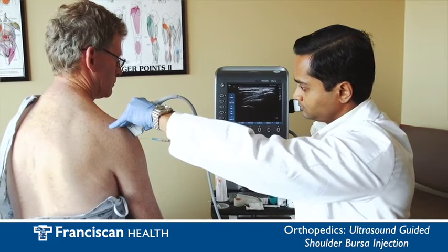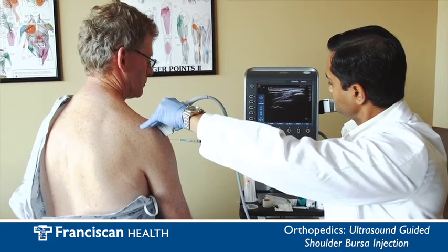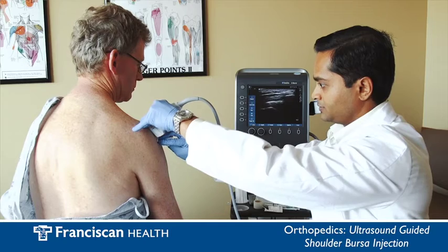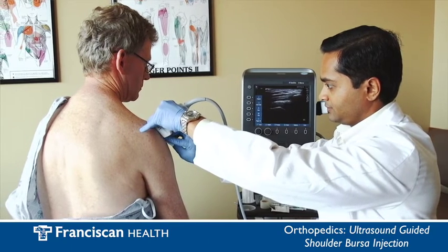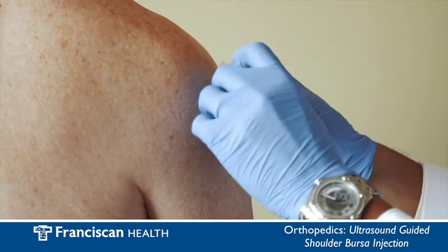Now that the exact injection site has been located and you are comfortable and informed I will finish the bursa injection. After the injection I will use gauze to clean off ultrasound gel from the skin and place a band-aid over the injection site.